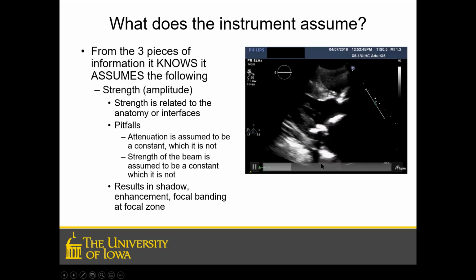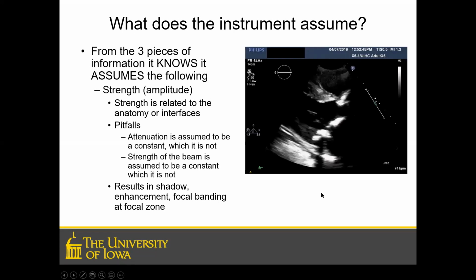So here's a classic example where we have some shadowing from MAC on this long axis.